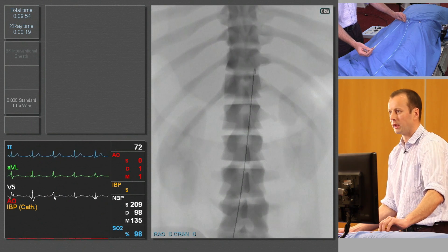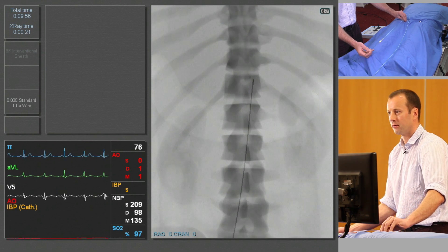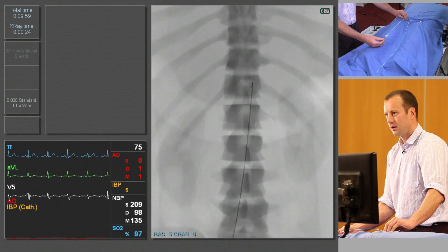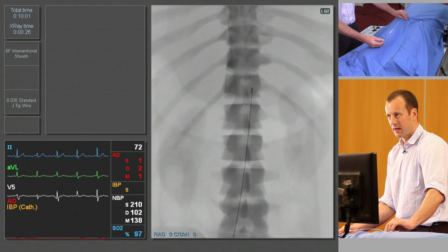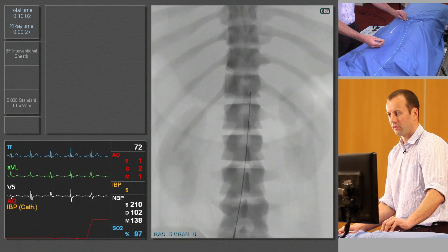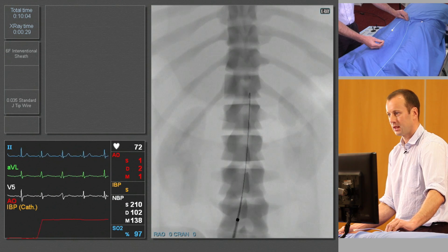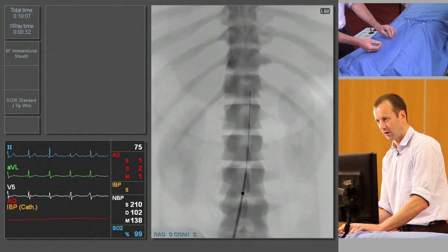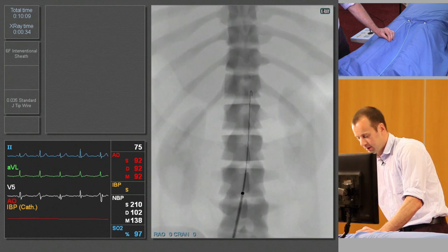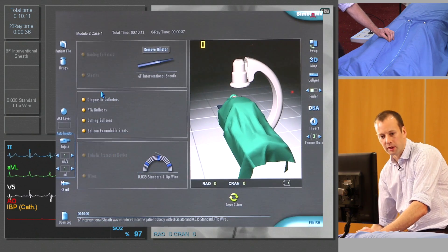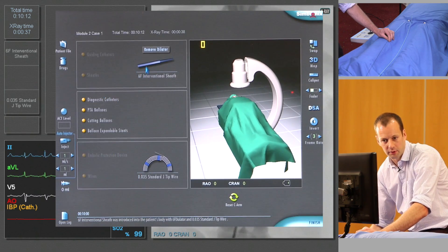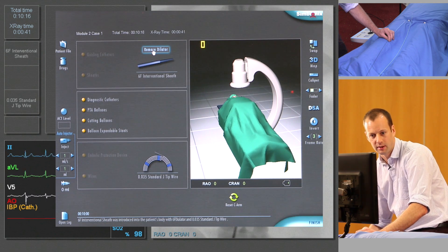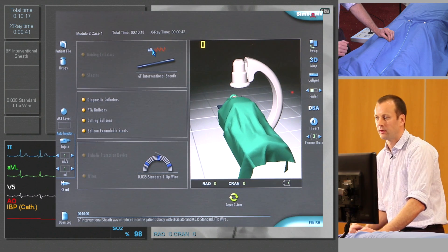I'm controlling the wire with my right hand and advancing the sheath with my left, keeping my left hand as close to the patient as possible. We'll advance the sheath into the distal abdominal aorta. Keeping control of the guide wire, I'm then going to remove the dilator from the sheath, and that's done automatically by the computer on this system.